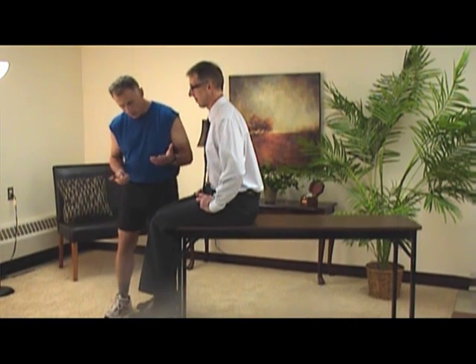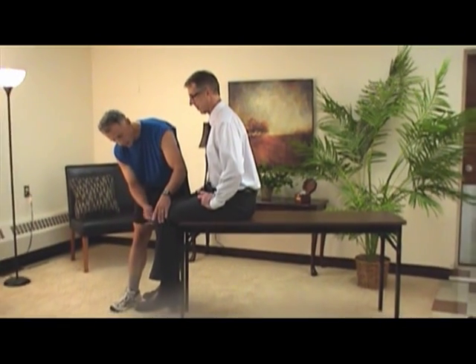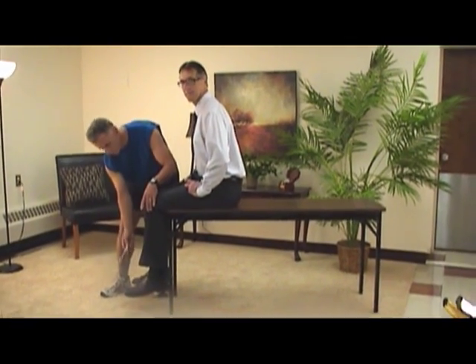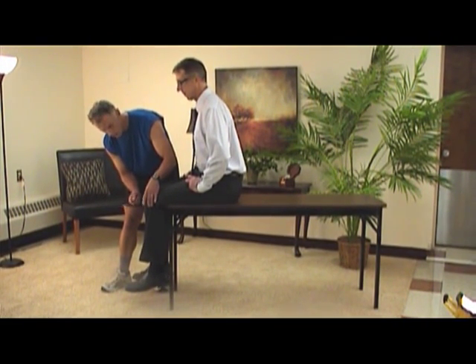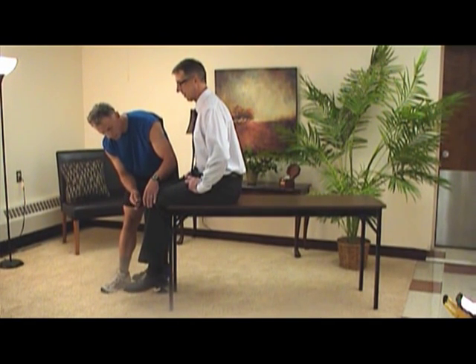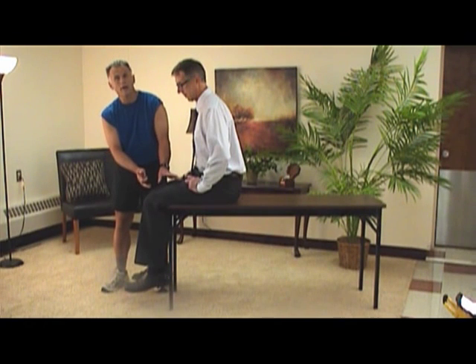I just want to say what they do with these. Oftentimes, you see this all the time on TV or the doctor's office — they'll tap on your knee, and they're looking for — did you see the little motion from Bob's foot? That's the reflex response. What's going on is when I hit the tendon between the patella and the tibia, it causes the quadricep muscles to briefly contract.